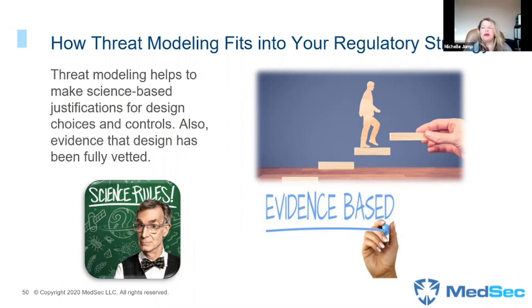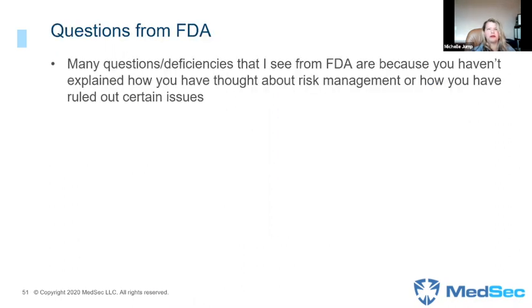Sometimes it's harder with risk management, right? Because a lot of people do their risk management through brainstorming activities, but a well-structured threat model can really put a lot of emphasis on the fact that you've done that thorough and complete step-by-step approach through the system.